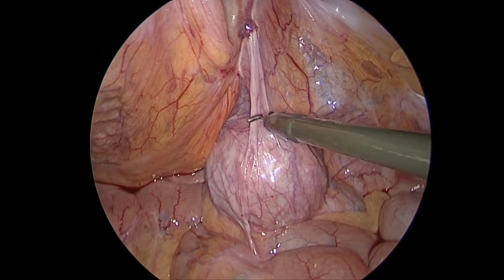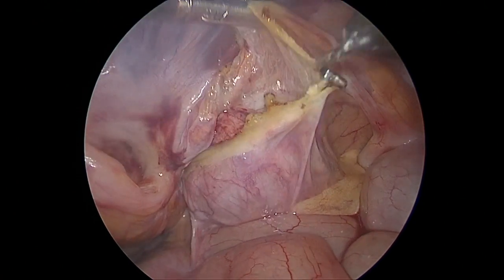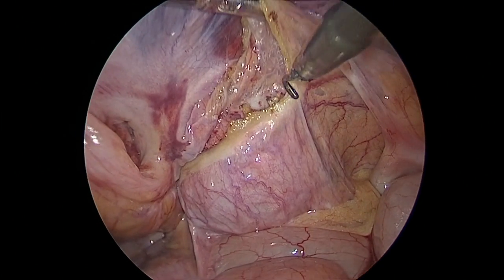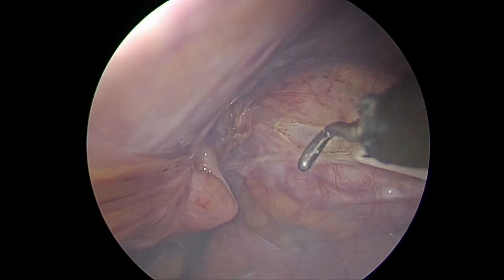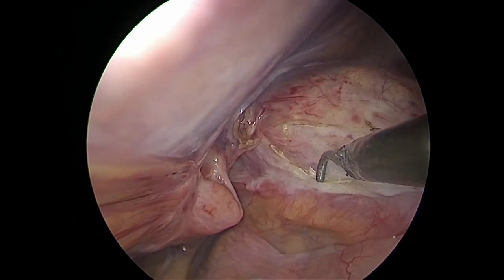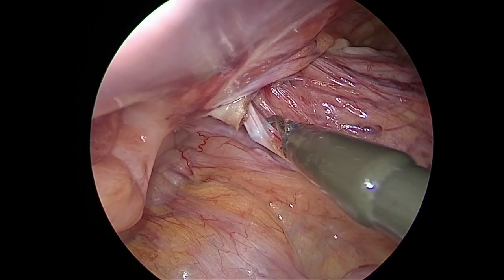I then put the same ports intraperitoneally, and now I am dissecting the cyst of the peritoneum which is encompassing it. So if you're on the right plane, you can dissect the peritoneum off it very easily.